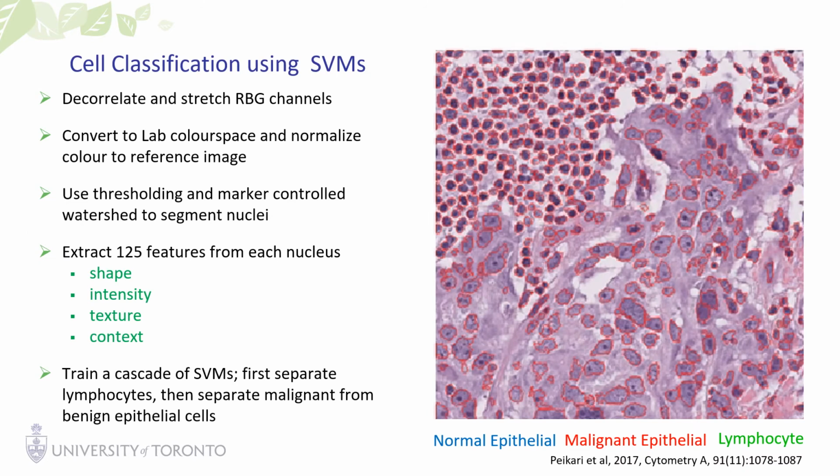So this is a patch from a project that we had in the lab where we were trying to quantify the percentage cellularity of cancer cells that were left after neoadjuvant chemotherapy in breast cancer. So the task is to determine what fraction of this patch is occupied by cancer cells, which are these larger nuclei here, versus lymphocytes and other stromal material and so on. So the workflow is as follows.